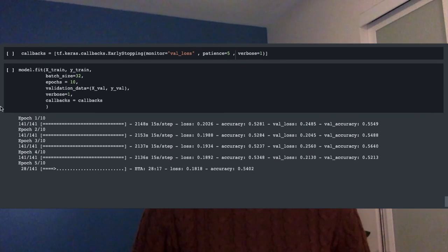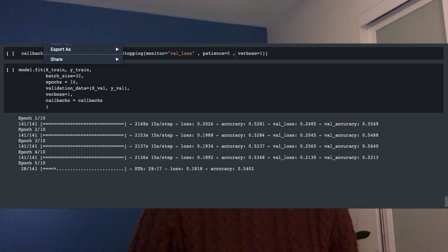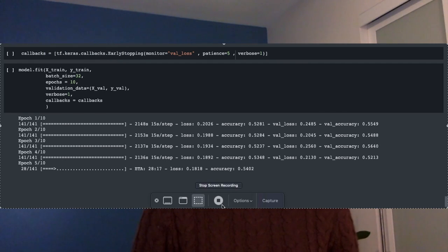The last few steps before compiling the model were to set up Inception, which was the model I used, global average pooling 2D to normalize the inputs, and dense to create connected layers. I then compiled the model and ran it, and got a 53% accuracy for 15 different classes.